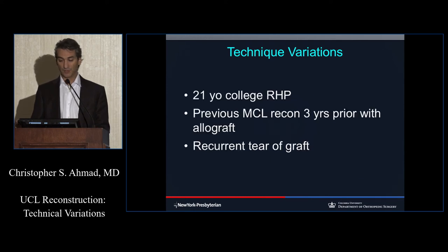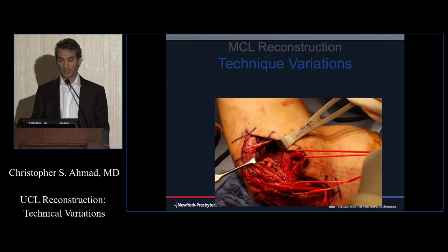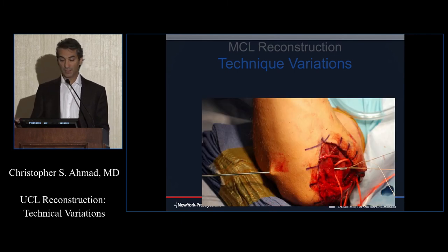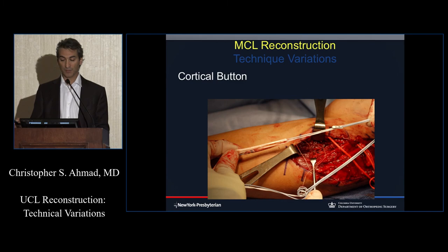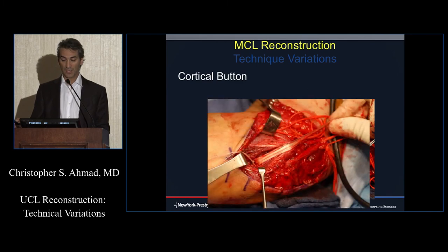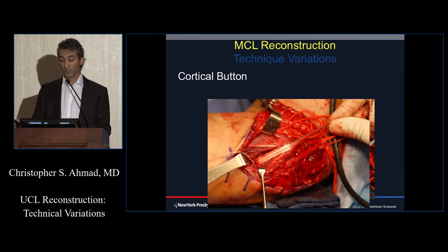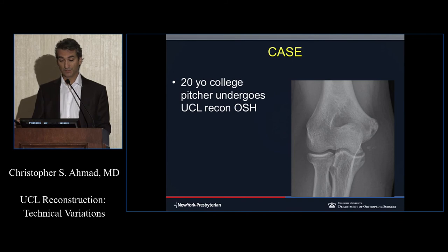Here's an example. He had a reconstruction, and it re-tore. So we make this hole in the sublime tubercle. He needed his ulnar nerve managed. And then here's this tunnel. And then we can take a pin, pass it across, and have a button like this that we can tension. And then we get fixation with a cortical button on the far side. This is probably the strongest fixation right here. And we don't even need a bone bridge. Okay, and then one last case.